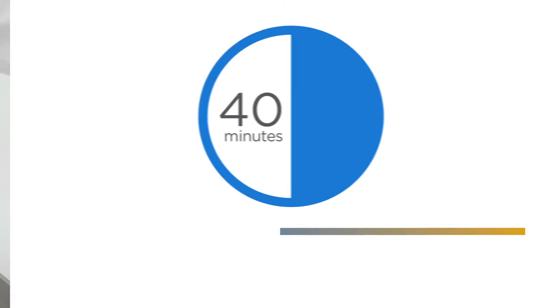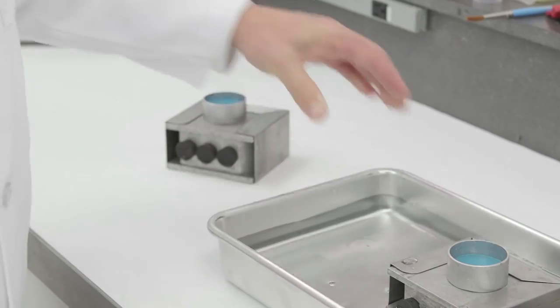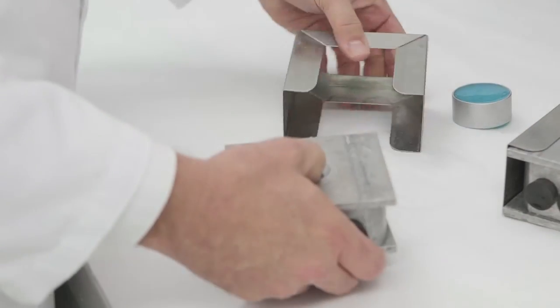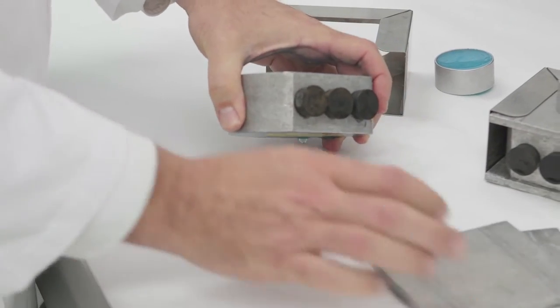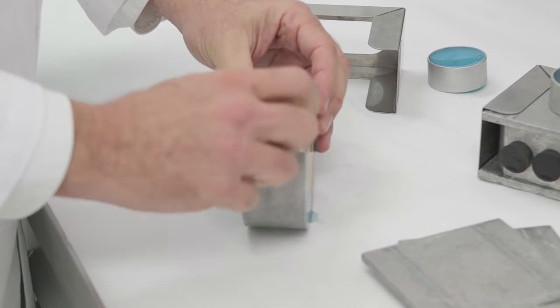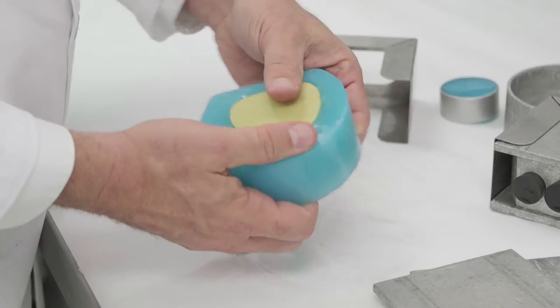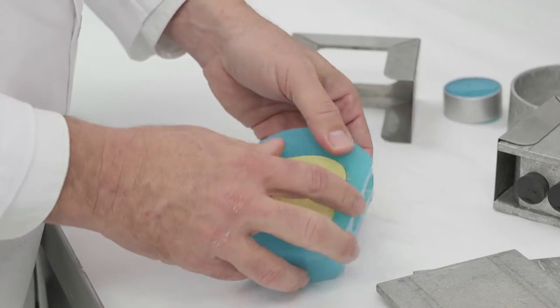After 40 minutes, remove flask from water and deflask. Then remove master model and wax up from the PolyFlex.